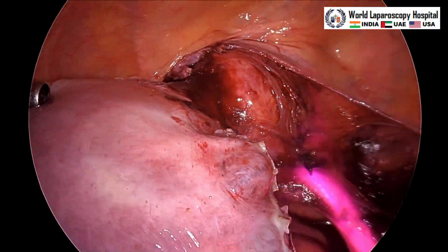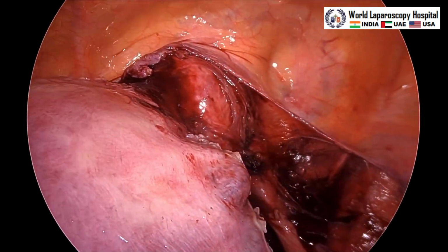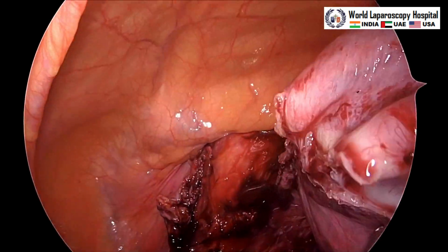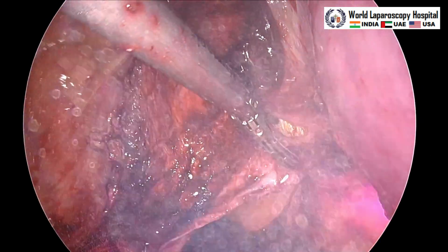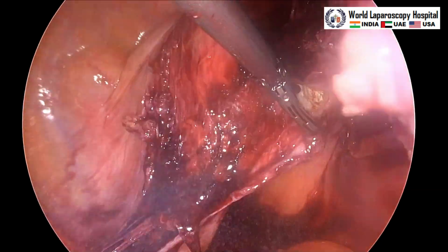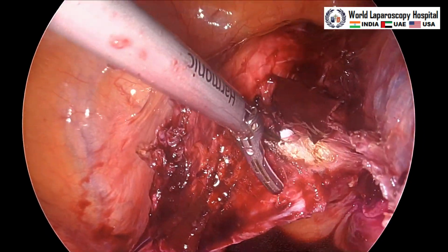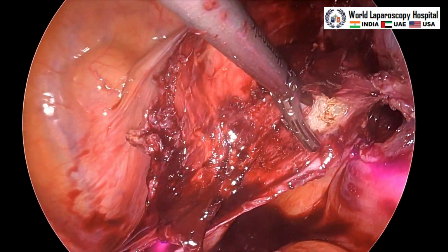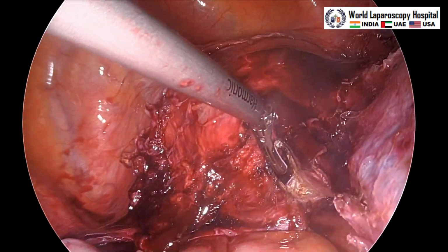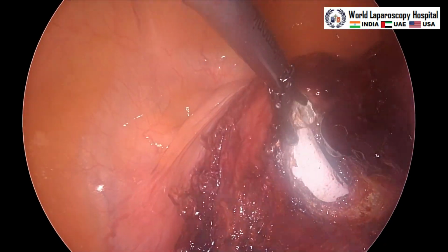So for the right side, the port instrument should come from the right, so that the tip of the instrument would be medially placed. And now here we will start colpotomy. So this is starting from 6 o'clock, and then above the arc of uterosacral ligament, this is colpotomy started. And slowly your assistant will rotate the uterus, and with the vibrating jaw of the harmonic you can do colpotomy, keeping it very carefully and stable.